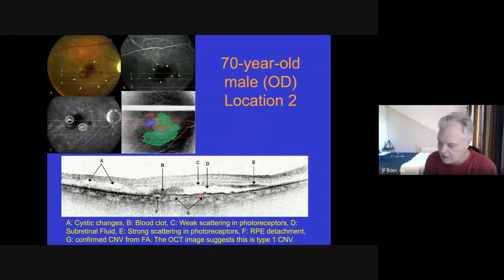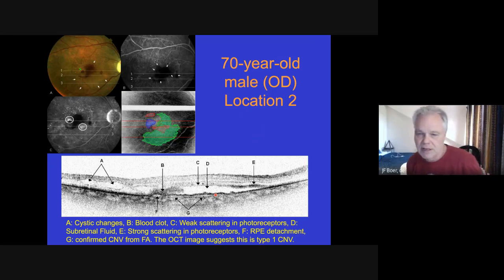They're leaky, and it's right in this area below the RPE that these blood vessels are expected to grow. What we see in this OCT now is the presence of this blood vessel layer that should not be there. So we have visual evidence of the presence of that layer.